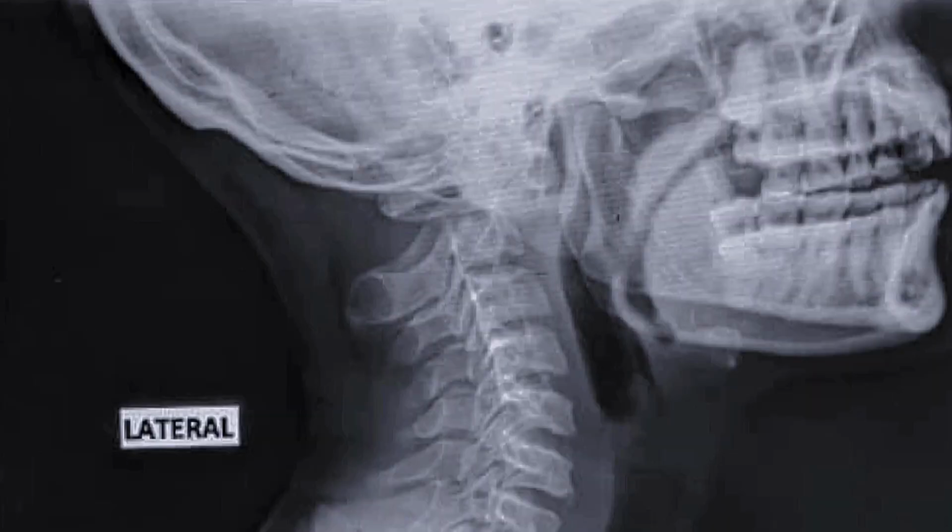So now on the image, when you look at the image, in X-rays there are only three colors. There is only black, then there is grayish, then there is white. When you check on the X-rays, you'll see there will be black, there will be white, and there will be some kind of grayish in some areas, right? So those three colors represent the three things I've been talking about, how X-rays interact in the human body. The one which is going to show very white is the bone, right?